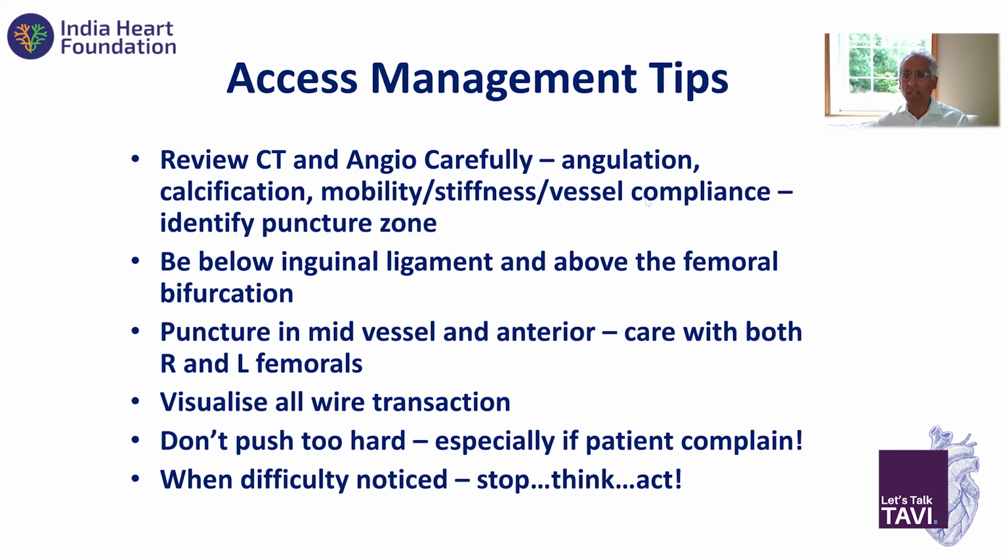It means there's a vessel that is not compliant, therefore will not stretch, therefore will only tear if something is pushed hard, and then you have a big hole that's difficult to deal with. Always puncture below the inguinal ligament and above the femoral bifurcation. Puncture in the mid vessel, for both the right and the left sides. And then visualize all wire transactions.